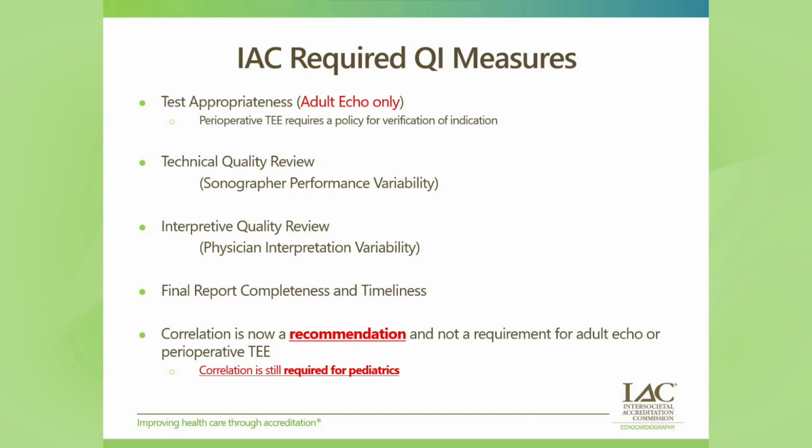So when you're looking at test appropriateness, you're asking yourself, is there any reason why I shouldn't be doing this test? Did the patient have the same test yesterday and they have no change in clinical status? Is there a more appropriate test that should be ordered for this patient? All sorts of questions you can ask when reviewing for test appropriateness.